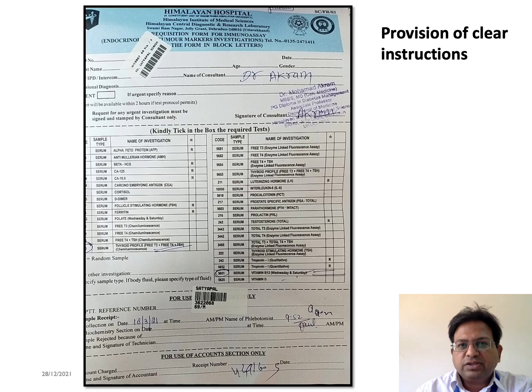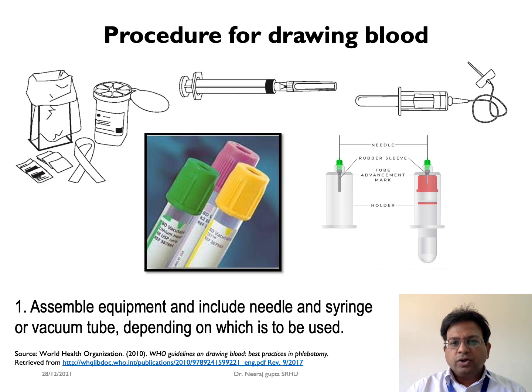Before you even start the procedure, make sure there are documented clear instructions for the blood sampling in a laboratory form. Now let's see the procedure of drawing blood.